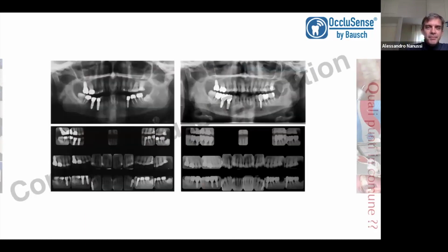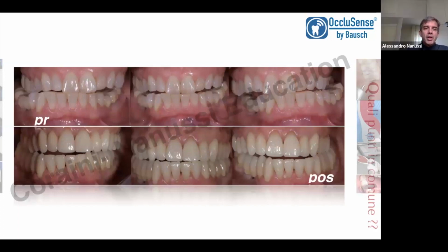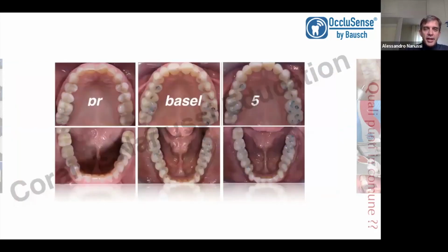But this woman has many problems, endodontic problems, periodontal problems, but also an important aesthetic need. She wants to be more beautiful in her anterior area, but to have a perfect anterior smile, you also need a perfect posterior occlusion. So we prepared for her a therapy that worked on the curves and the anterior teeth with veneers and crowns in the posterior area, with provisional treatment in the middle. You can see the difference in contacts that are important.